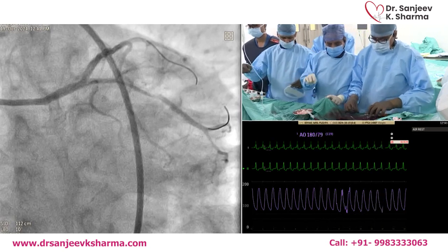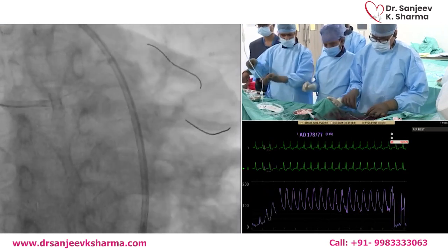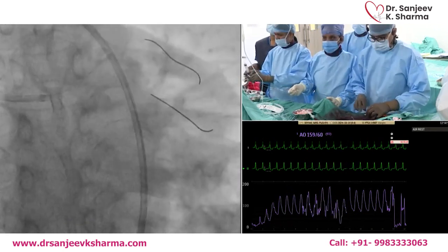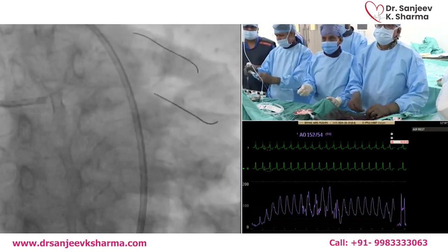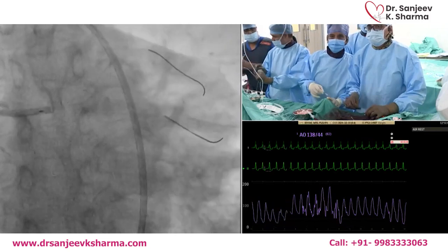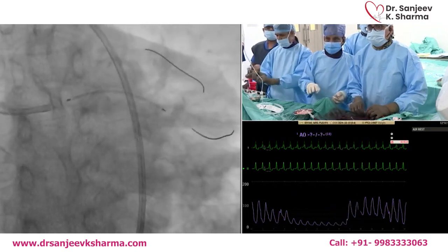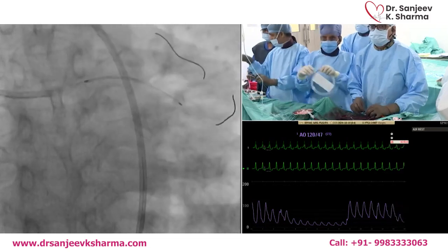So we'll go now with a long stent in the circumflex. Yep, that's what we are doing first. And the mini crush with the left main LAD stent. I suppose what do you use? 33 or 38? 38. Yeah, that was the whole question, 33 versus 38. We thought let's cover completely. There is not much penalty in the circ because there is a good landing zone. Advance the wire more of the circumflex wire. Very good. It's a little long, but it's better, no penalty, as you say.